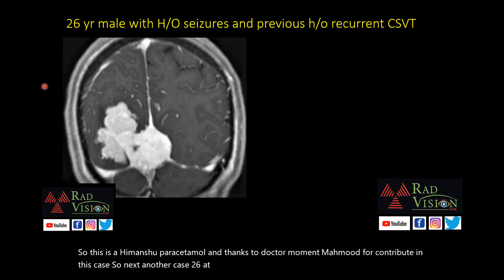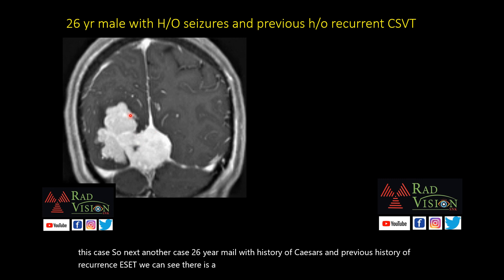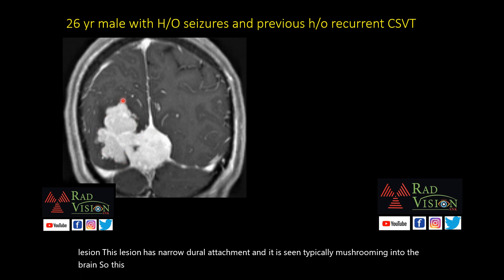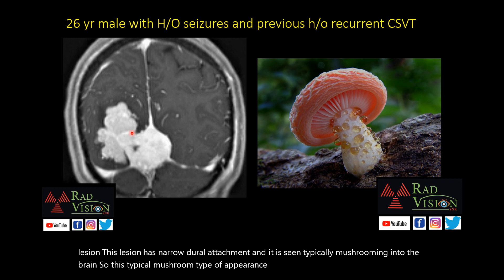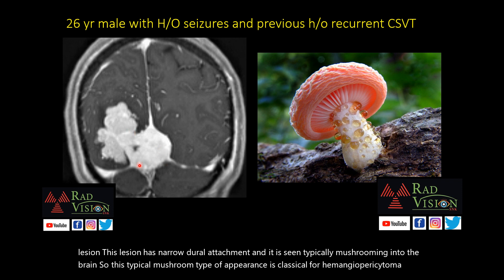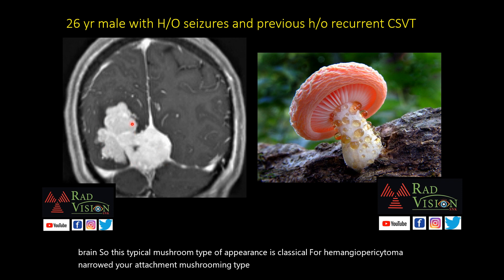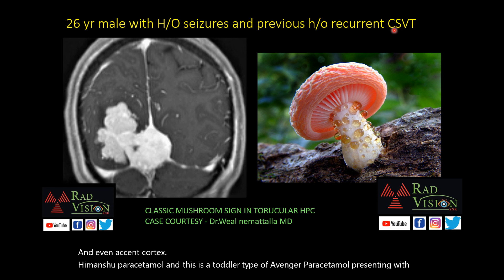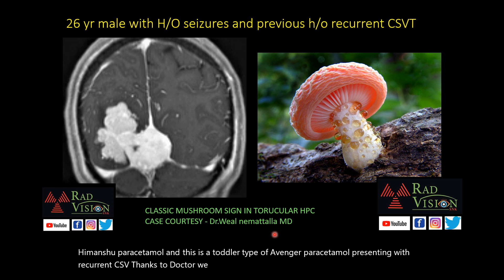Another case: a 26-year-old male with history of seizures and recurrent CSVT. There is an intensely homogeneously enhancing lobular mass lesion with a narrow dural attachment, typically mushrooming into the brain. This mushroom-type appearance is classical for hemangiopericytoma. Narrow dural attachment and mushrooming growth into the brain with adjacent cortex involvement favor hemangiopericytoma. This is a torcular hemangiopericytoma presenting with recurrent CSVT.